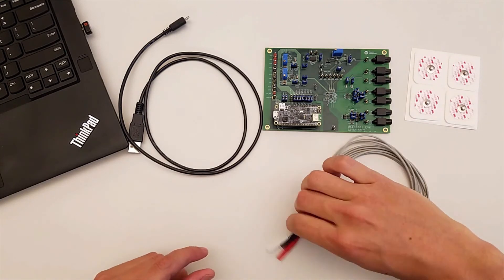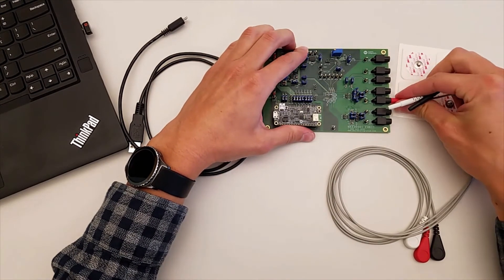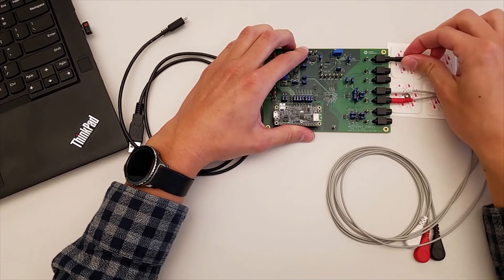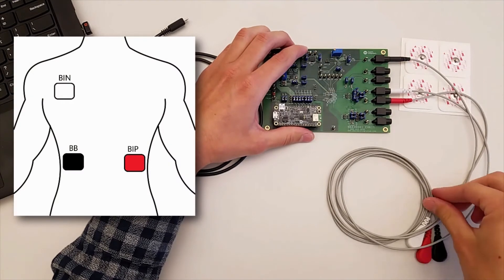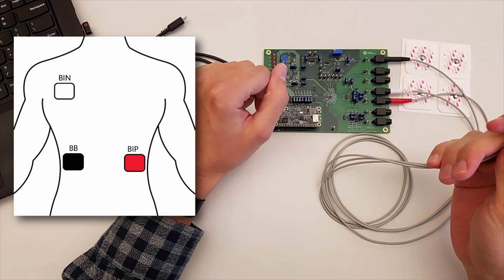Next, take the three included ECG leads and connect the red to BIP, white to BIN, and black to BB. Take the other ends and connect them to the ECG electrodes placed across your chest like in this diagram.